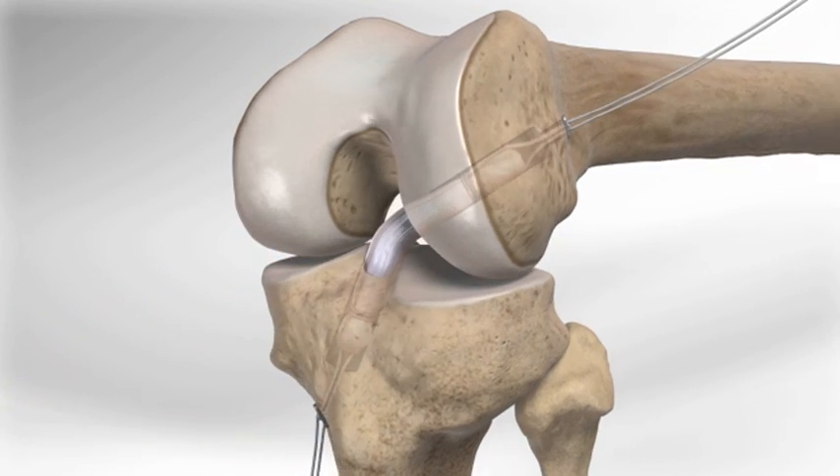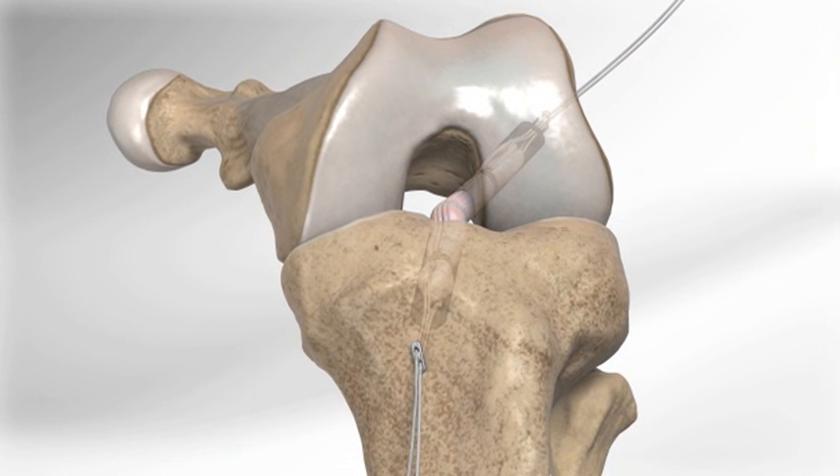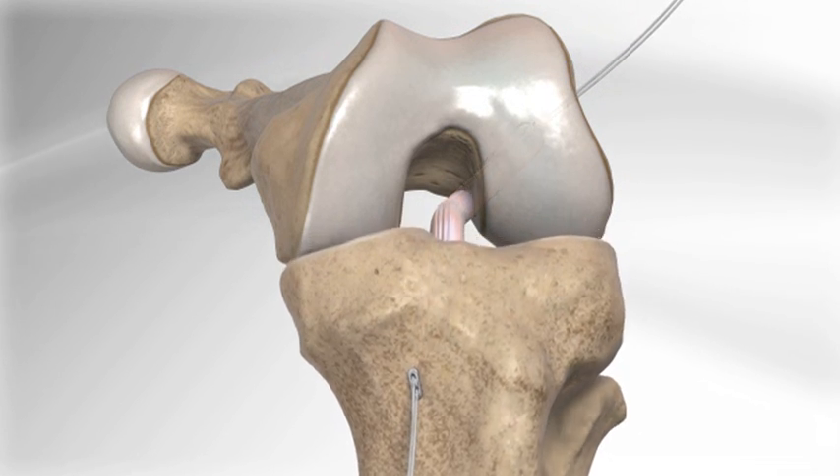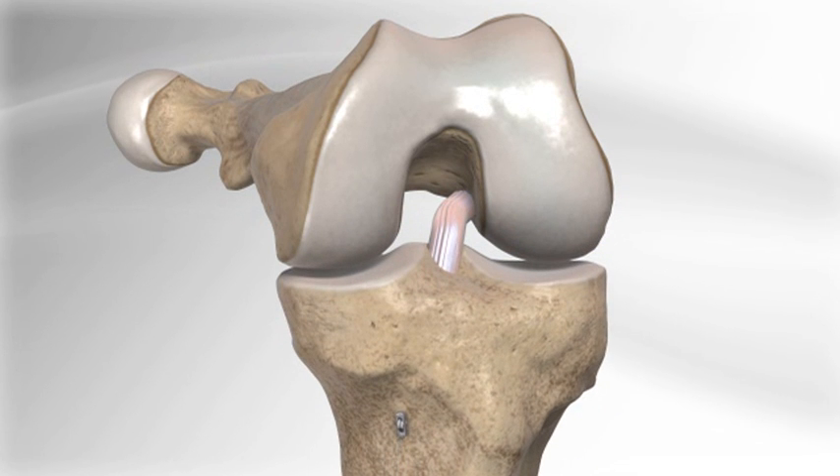The tibial end of the graft is passed in similar fashion, and the white sutures are pulled to adjust the graft into the tibial socket. The adjustable tightrope implants allow the surgeon to optimize the fit of the graft into the femur and tibia and achieve appropriate tensioning. The graft is now secured into place until it heals to the bone.